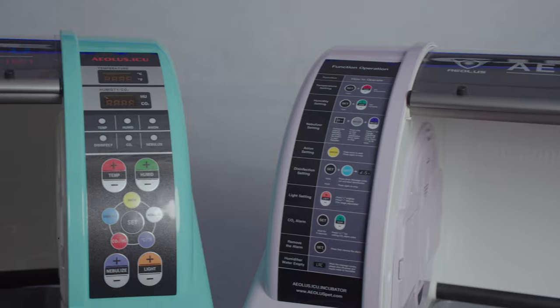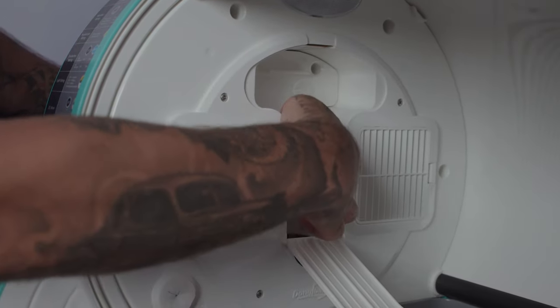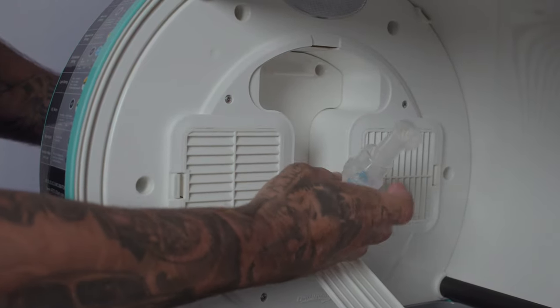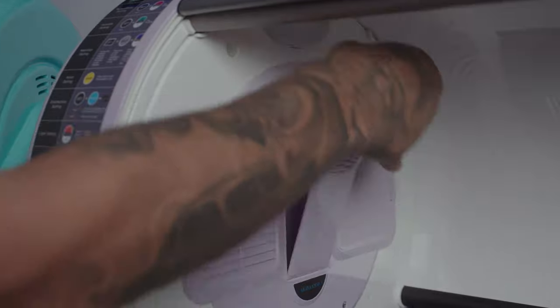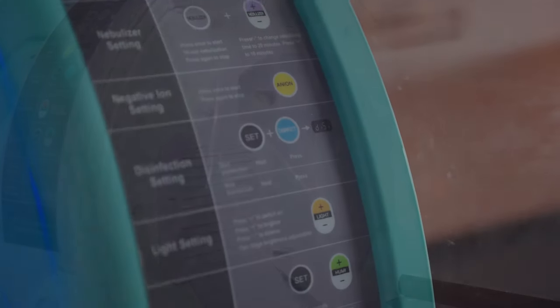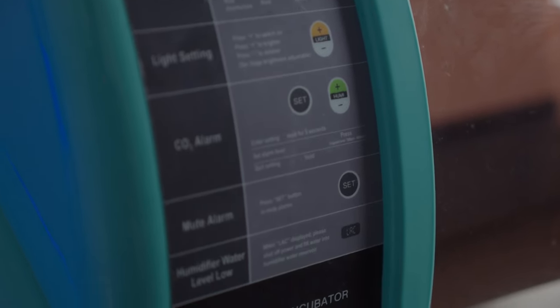What's the big difference between the 1801 and the 1803? The difference is the built-in nebulizer. The 1801 comes equipped with a built-in nebulizer while the 1803 does not. Function operation instructions are included and labeled on the front of each ICU for easy reference.